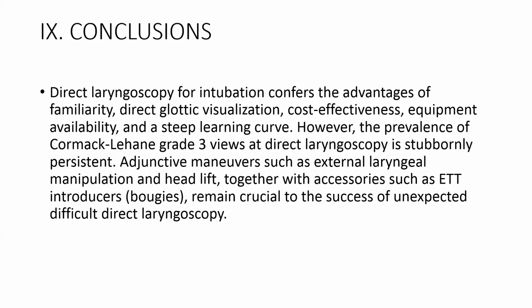So direct laryngoscopy for intubation gives the advantage of familiarity and direct glottic visualization, cost effectiveness, and ready availability, and a steep learning curve. That means that you actually learn quickly. A steep learning curve is a curve where you acquire information, you acquire skills quickly.